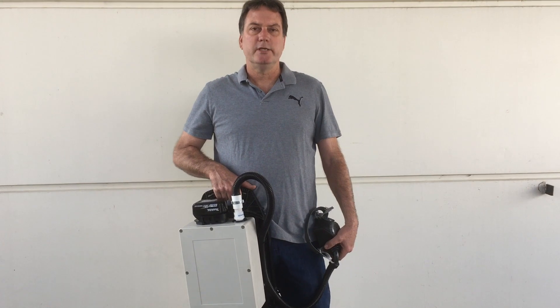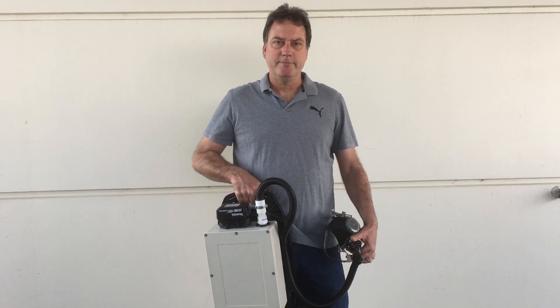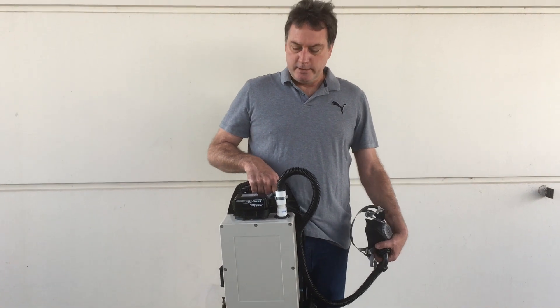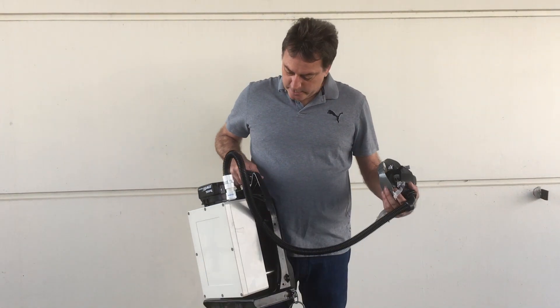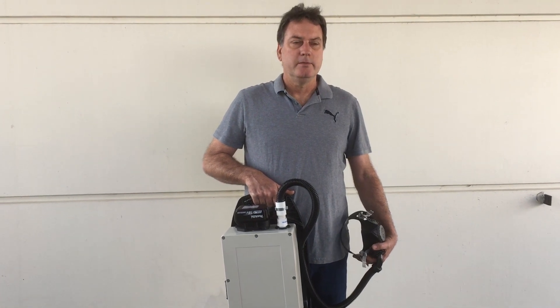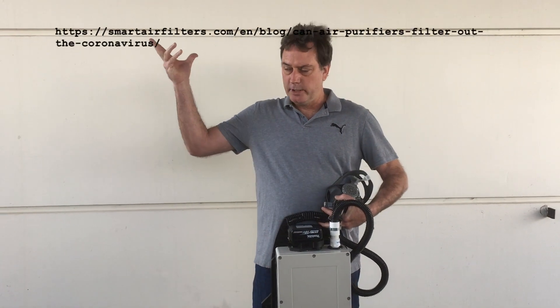It's March 6th of 2020 and the coronavirus is upon us, so I decided it's time for me to build the respirator I always wanted for working in dust and working with paint — and if I have to, I can use this for going in public. I'm not an expert on HEPA filters, but I put a HEPA filter in here because I think there's some evidence that it works well against viruses, and there's a link here for you to read up on.